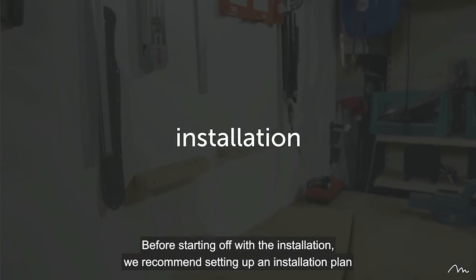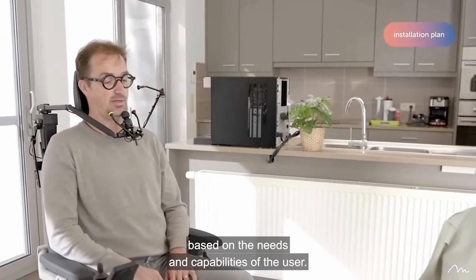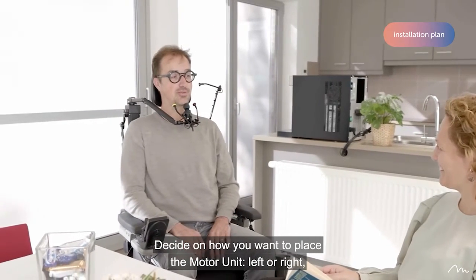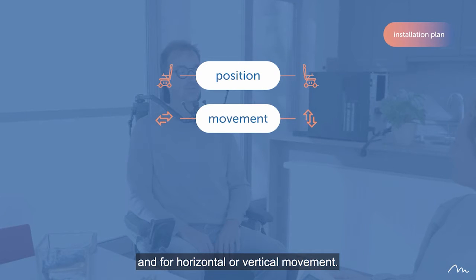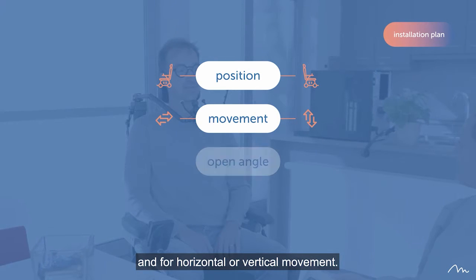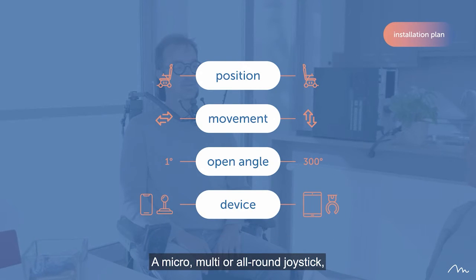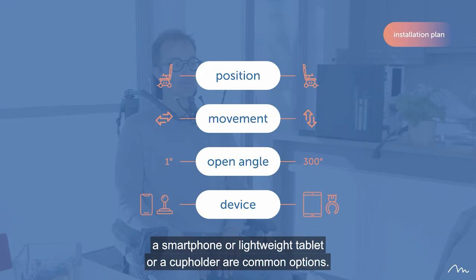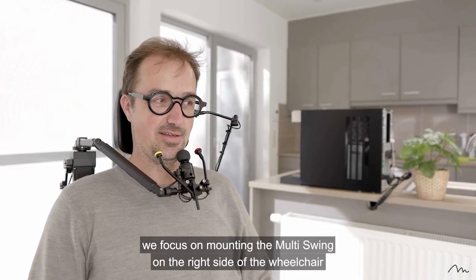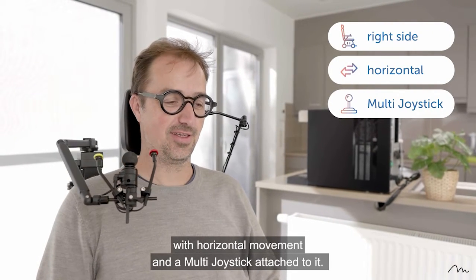Before starting off with the installation, we recommend setting up an installation plan based on the needs and capabilities of the user. Decide on how you want to place the motor unit, left or right, and for a horizontal or vertical movement. Define how far the arm should open and which device you want to attach to it. A micro, multi, or all-round joystick, a smartphone or lightweight tablet, or a cup holder are common options. In this video, we focus on mounting the Multiswing on the right side of the wheelchair with horizontal movement and a multi-joystick attached to it.